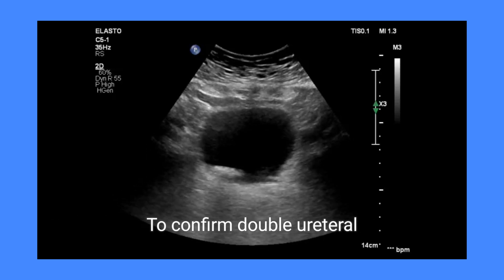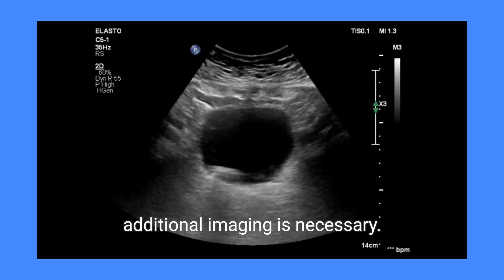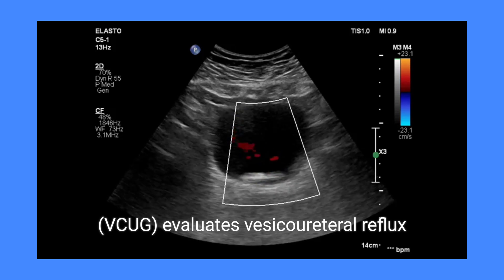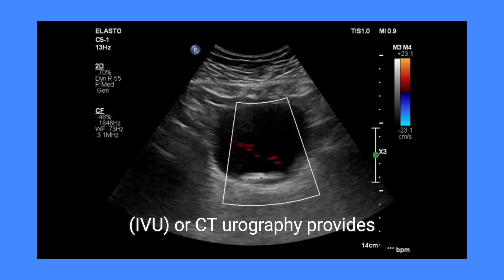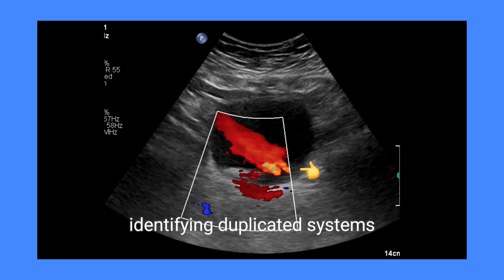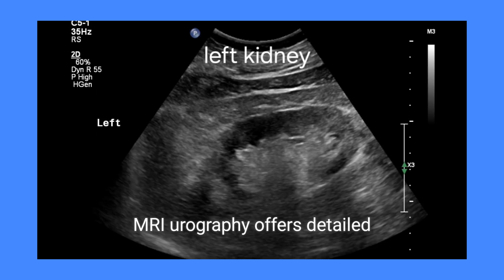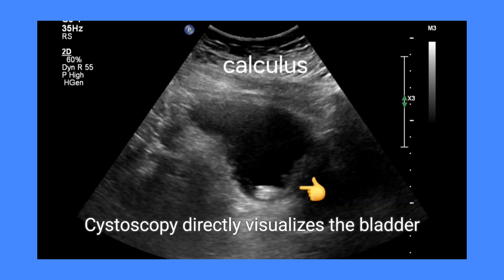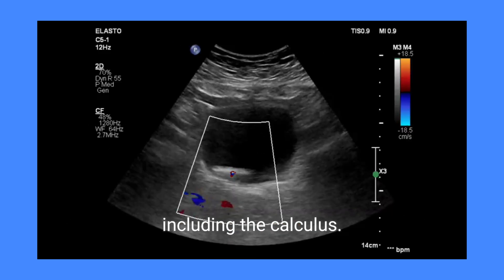To confirm double ureteral orifices at the left VUJ or other conditions, and to assess the bladder calculus, additional imaging is necessary. A voiding cystourethrogram (VCUG) evaluates vesicoureteral reflux and ureteral orifice anatomy. Intravenous urography (IVU) or CT urography provides detailed imaging of the kidneys, ureters, and bladder, identifying duplicated systems or ectopic ureters and visualizing the bladder calculus. MRI urography offers detailed images without radiation, including assessment of the bladder calculus. Cystoscopy directly visualizes the bladder and ureteral orifices to confirm double orifices, assess abnormalities, and evaluate the calculus.